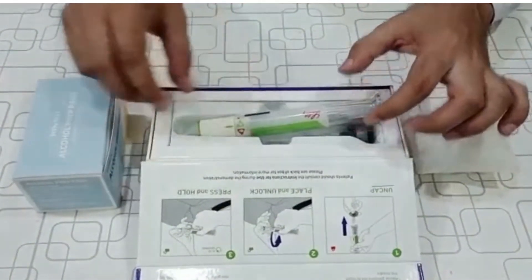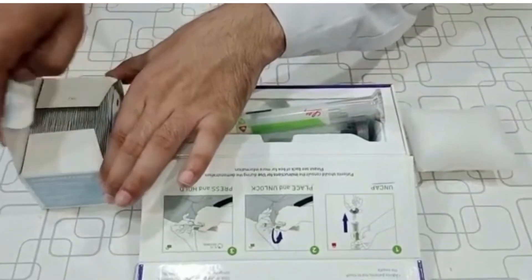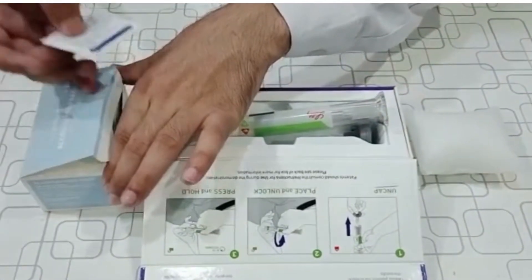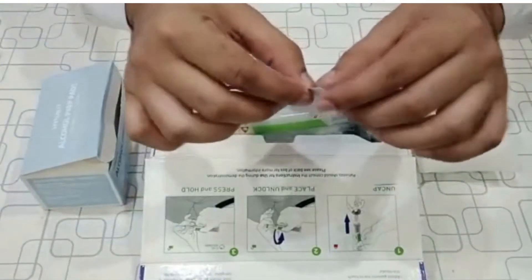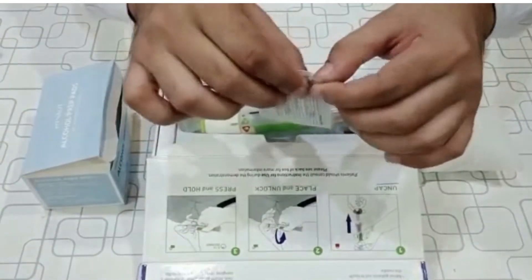It should be noted that before injecting the medication, the patient needs to clean that particular area—that is abdomen, thigh, or back part of the upper arm—with an alcohol swab.